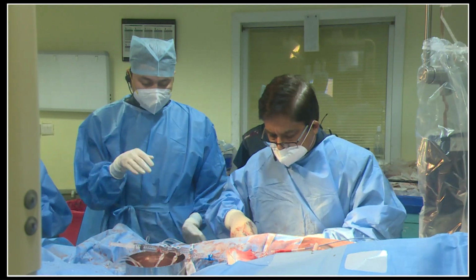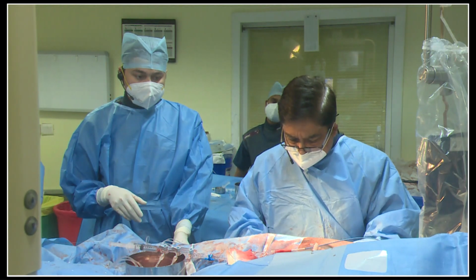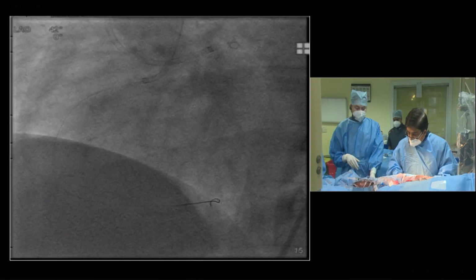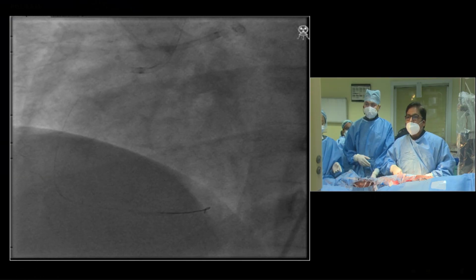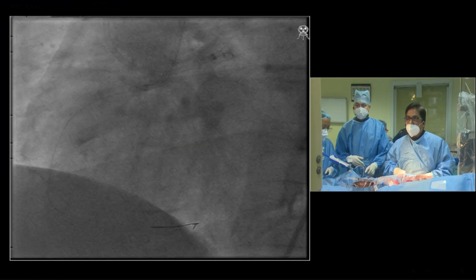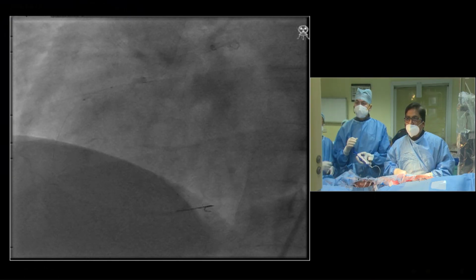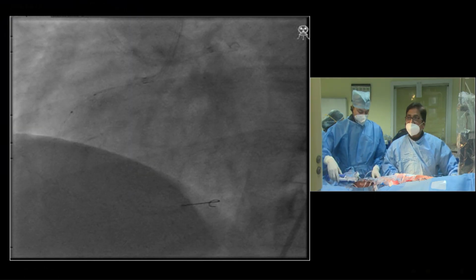The other thing we do is to remove the injector syringe from the catheter that you don't want to inject. So once you've got antigrade, we just remove the syringe from the retrograde, bring it forward, so that we don't keep on injecting into the antigrade or the retrograde whenever you don't want it to be. Correct. Now it is a very important example actually where he wanted an injection from the right system, but the injection came from the left system. Come on, test please. Small test from the right.